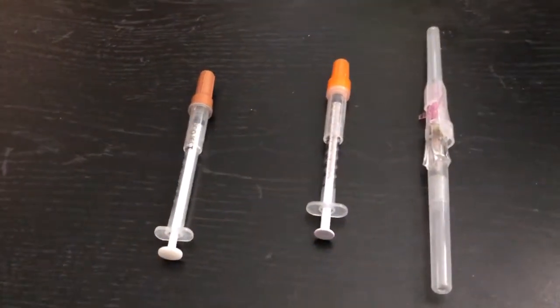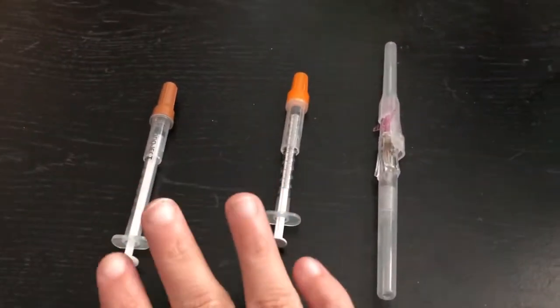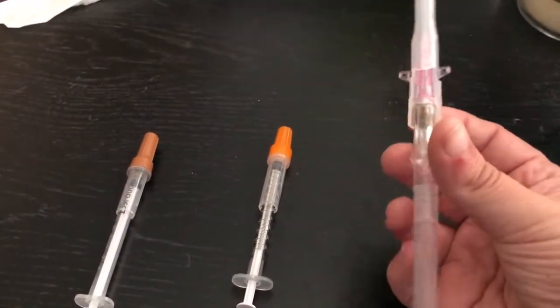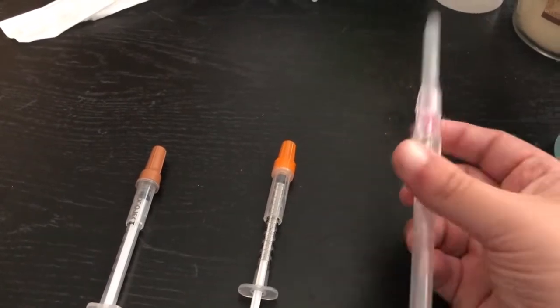So I'm going to show you what not to do, and then I'm going to show you how easy it is to use the built-in safety features that these needles have. I'm going to flip the camera around and start showing you. Okay, so here are my three needles. I'm going to uncap one of these needles and show you what not to do, but this needle here has a very cool safety feature built in, and I wanted to show you how it works.